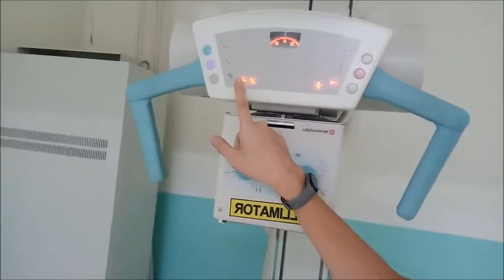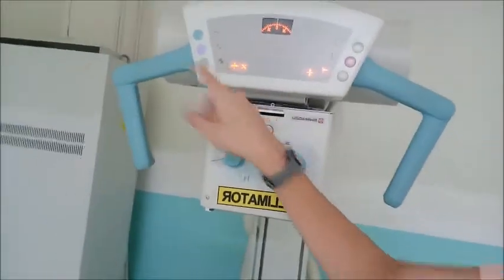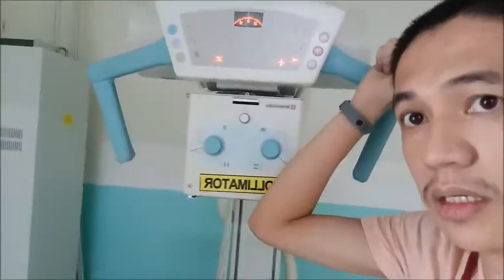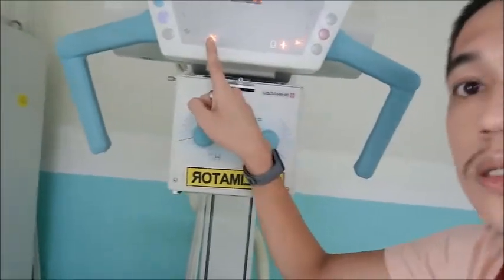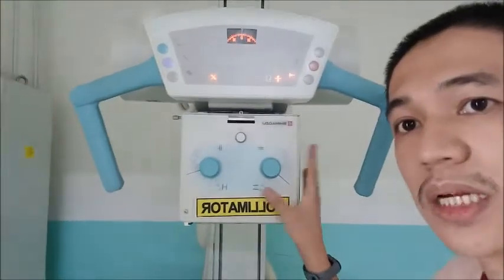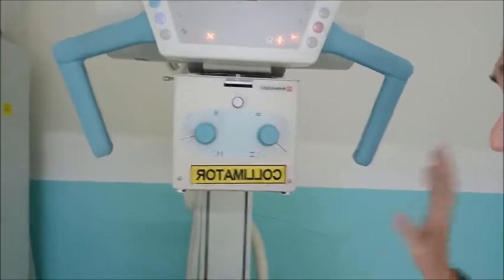So it is okay if the light does not turn on for the 72. That's okay. We are not dealing with the chest stand already. For this type of machine, again, you have to be very familiar with your tube and your equipment.